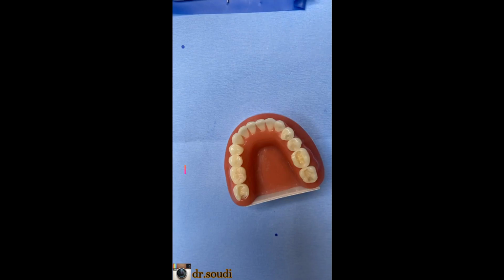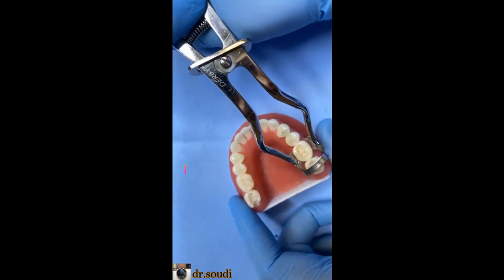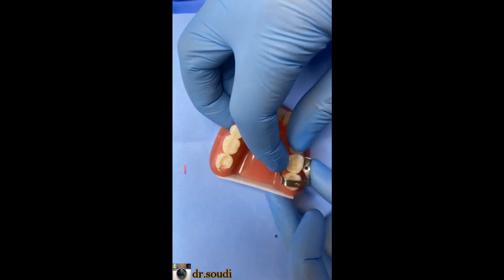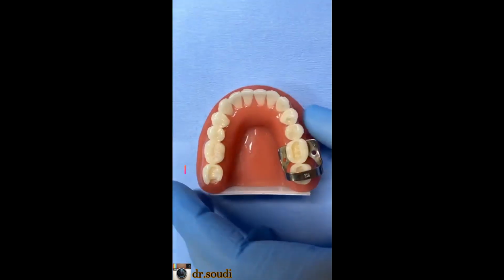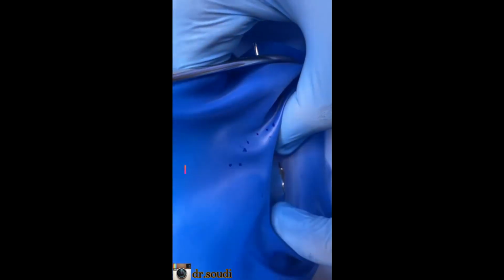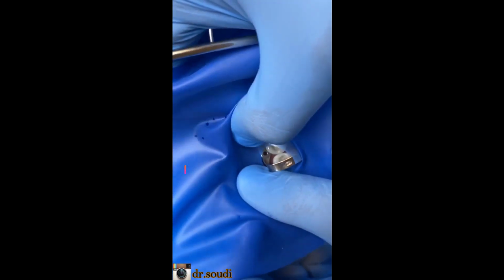In English again, there are many techniques. The first technique is to place the clamp first. After you make displacement for the clamp, the clamp is retentive as we said. Now we have a hole here for the clamp, so we stretch it like this. It will not be cut, hopefully. And you can pass your clamp like this.